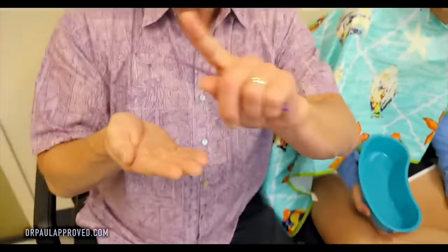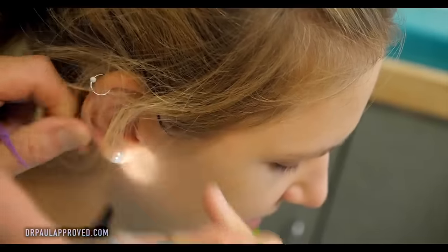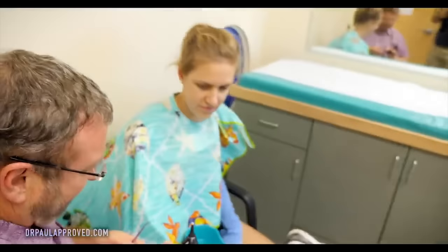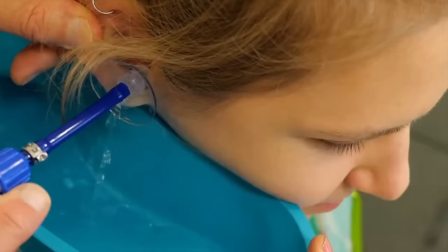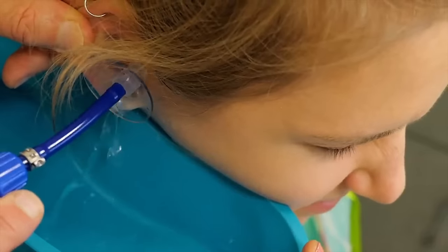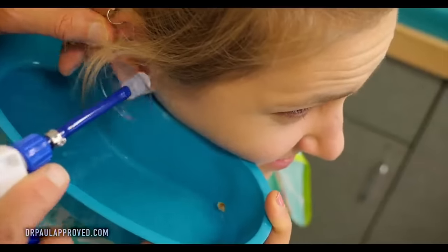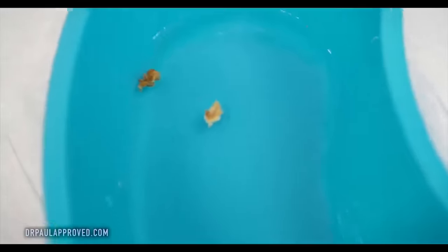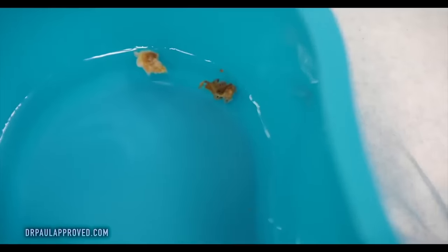No, no, no — I'm not going to taste it. Looks much better. We're not quite all the way there; there's more in there. I'm just seeing if we can get the rest of it out. There was. Oh, look at those little babies. It's so funny. Perfectly clean here.